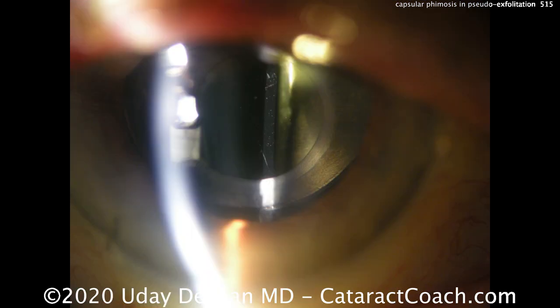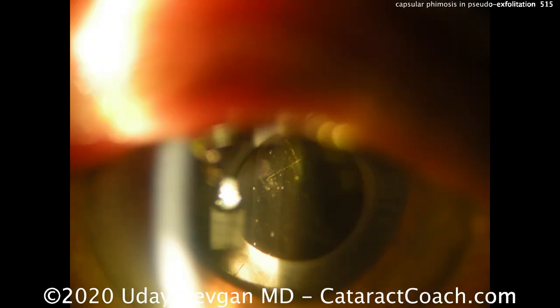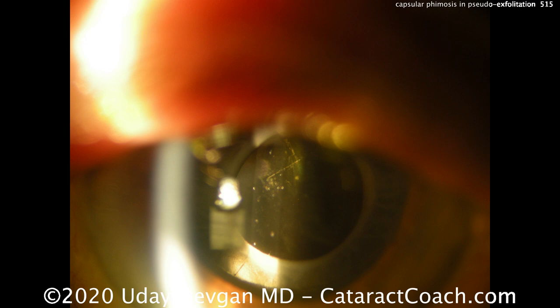Let's look at the other eye — it's already been operated on and looks pretty good. But look carefully. Is there capsular phimosis? There is capsular phimosis. The lens is a six millimeter optic, but the capsular opening today is less than four millimeters in diameter. That means there's been a lot of contraction of the capsule. Now look at the big gap between the iris and the anterior lens capsule — that's going to change our lens calculations.